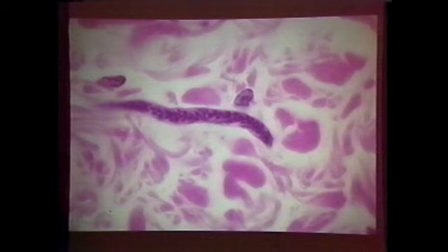And I feel that it's Onchocerca lienalis from cattle. We have tried to infect dogs numerous times with Onchocerca volvulus to make a laboratory animal model, and we have always failed. But we have never taken lienalis and tried it in dogs.